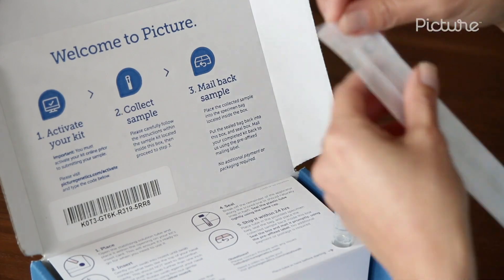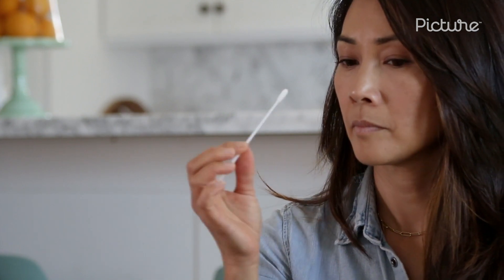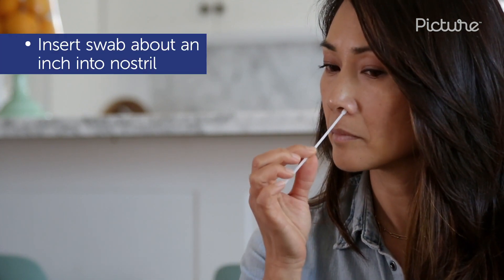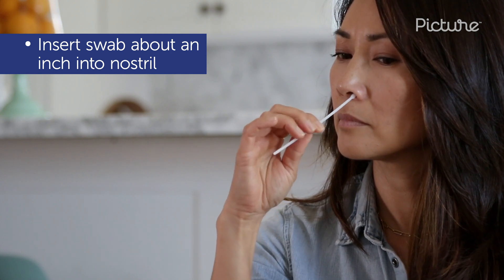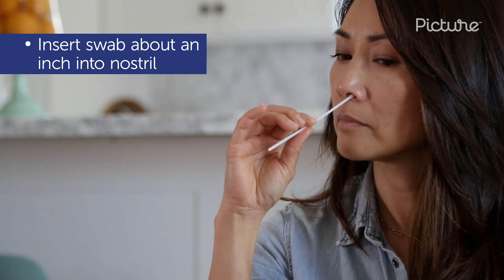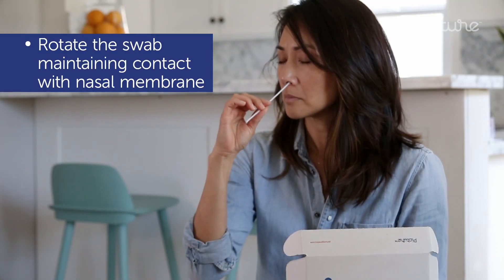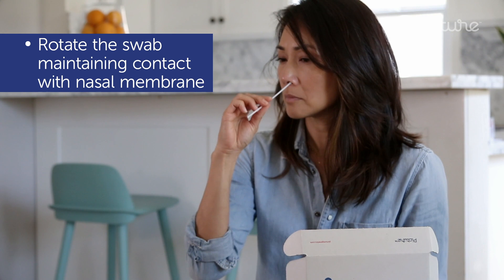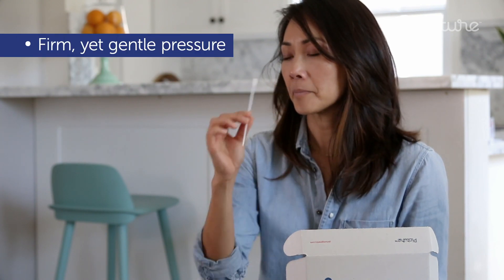Next, open the nasal swab. It is sterile and should not touch anything before or after collection. Gently insert the swab into your nostril until it contacts what feels like the top of your nasal cavity. This should not lead to discomfort and should not go further than about an inch or less into your nostril. Rotate the swab against your nasal wall a few times in a circular motion using a firm yet gentle pressure while keeping contact with the nasal membrane.